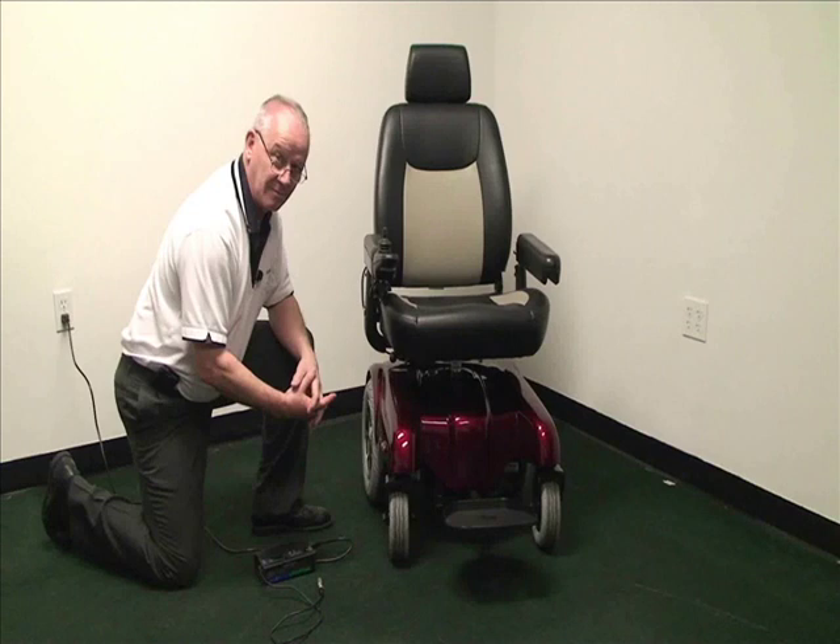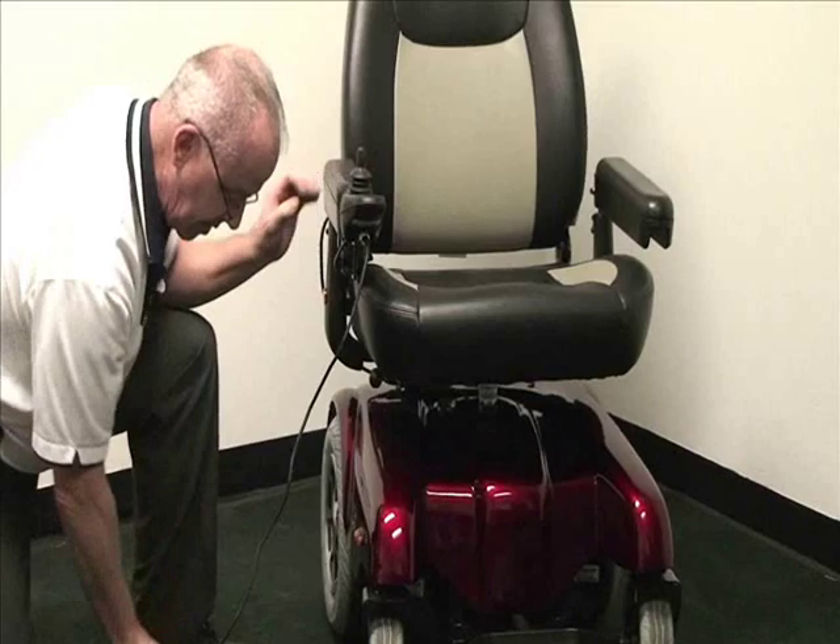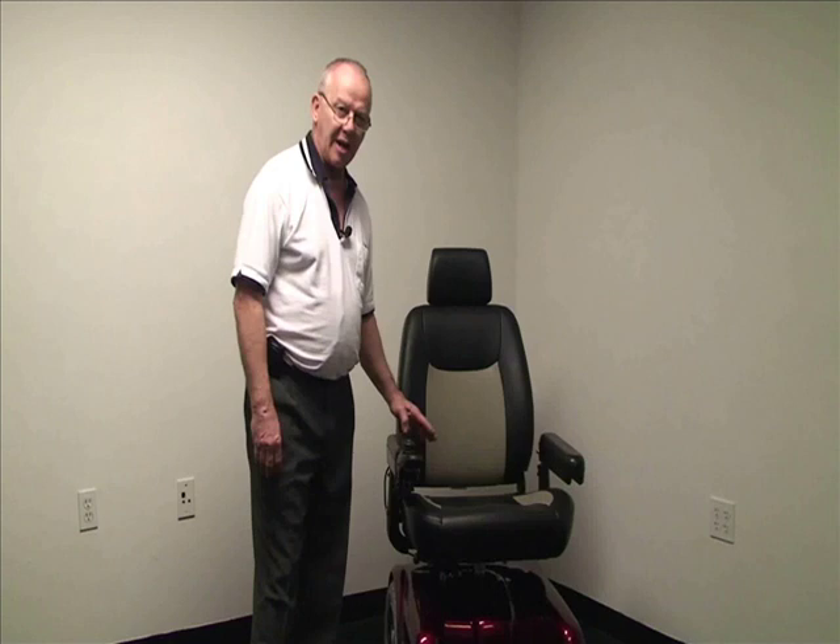The unit includes two 12-volt 22NF batteries and includes a 5-amp charger. Charging the unit is as simple as plugging the charger into the front of the joystick and turning on the switch. A fully charged unit has a range of up to 20 miles depending on the terrain.